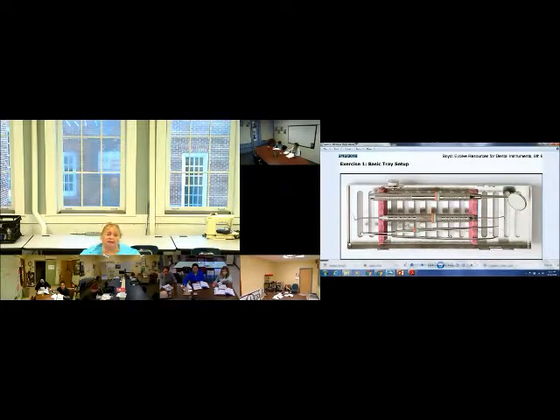So this is an instrument cassette, or in one bag. And other offices include these as part of their larger setups. So it will depend on how they are stored, but almost every office has these three together separately because sometimes that's all you need is a basic setup to check the oral cavity.